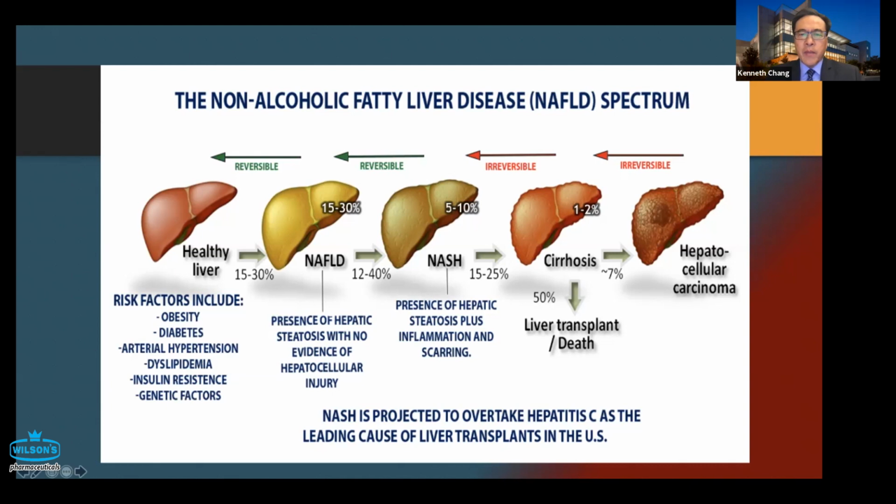One unmet need is, despite all the wonderful non-invasive tests that we have, I would say that you cannot make a diagnosis of NASH firmly without a liver biopsy. So one area of need is here, being able to sort out which patients have NAFLD and which patients have NASH. And EUS guided liver biopsy, I believe, will become more and more important in this space.